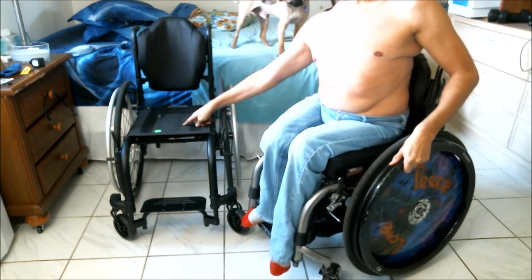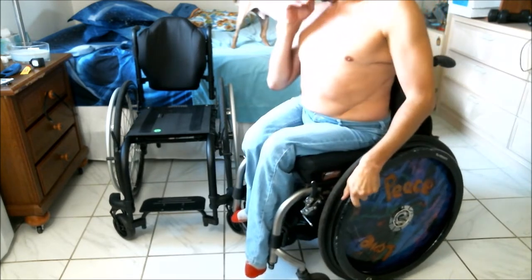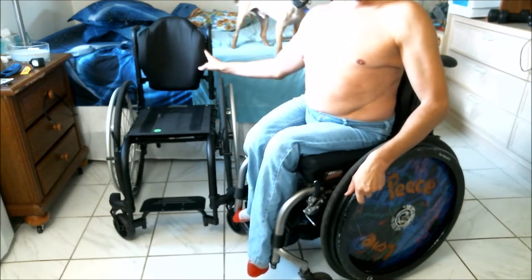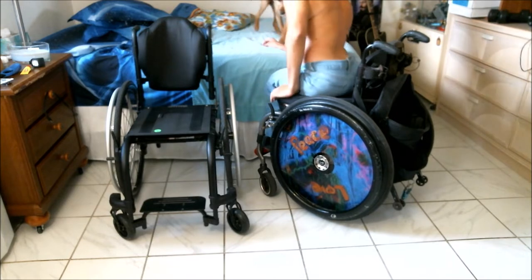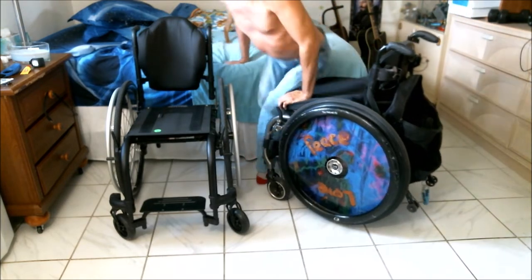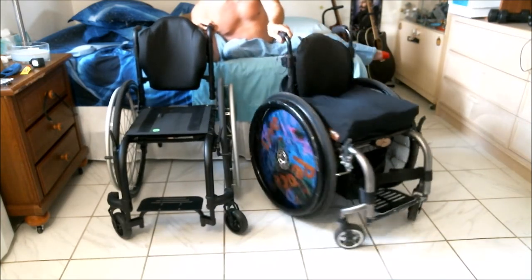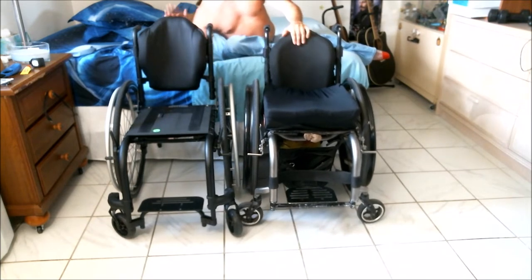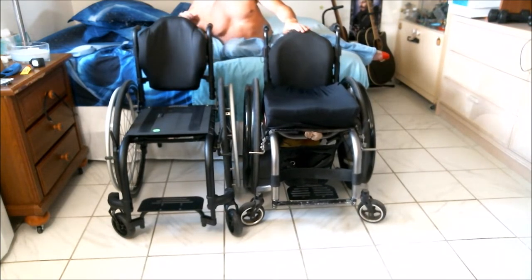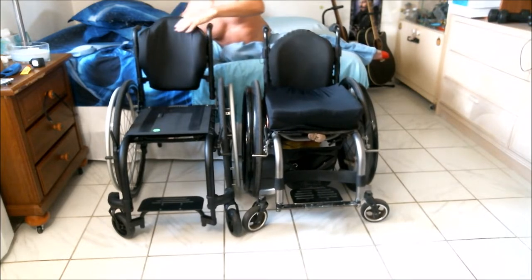So now you can see the back is on, and there's no seat cushion on here right now - I'll get into that shortly. If I put the chairs side by side, you'll be able to see that this new back is much, much higher than the old one. In fact, it comes above the push handles. If someone were pushing me, the new seat back comes much higher than the push handles, whereas this seat back is a decent amount lower.